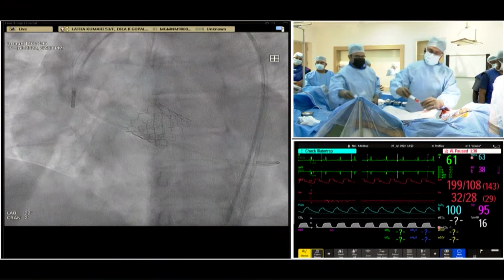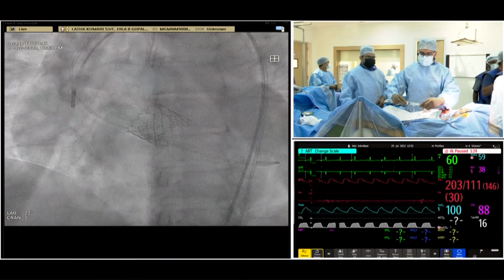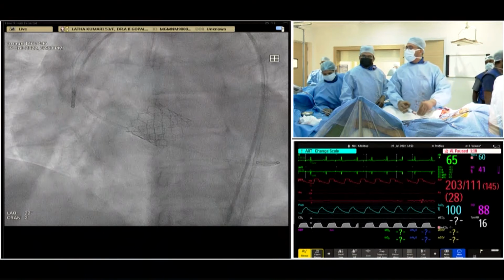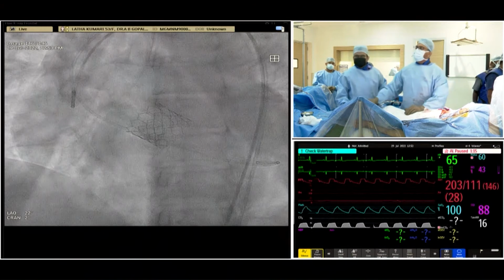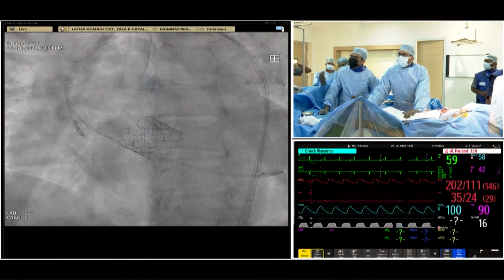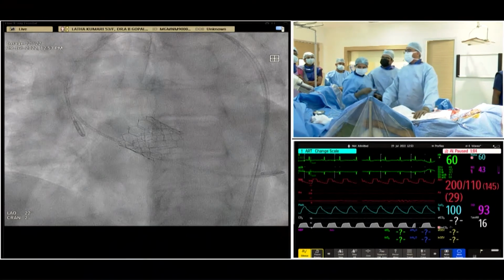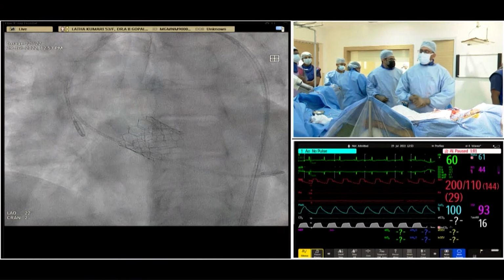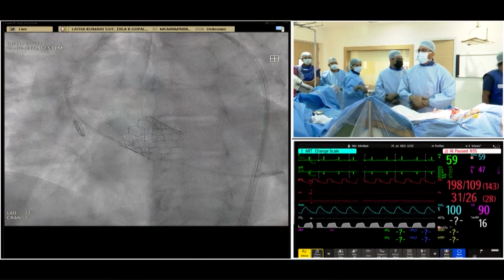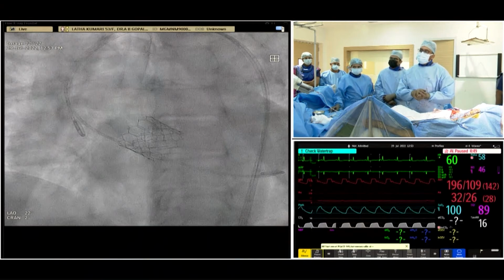Any questions, any comments, anything to discuss? We're just going to close off unless you want to see closure, but I will leave that to the panel to decide. Yeah, so did you see AR? What was the reason for post-dilatation? Because I could see there was about 1 millimeter, I saw just with the injection with the delivery system there, and I thought there was a little bit of room. I put a 23 nominal, 17, and as a policy, I always have a bailout syringe next to me with 3-4 ml. I make a decision based on the fluoro screen that I see. If there's room, and if I can still pull the valve up from wherever it is, I would do that.